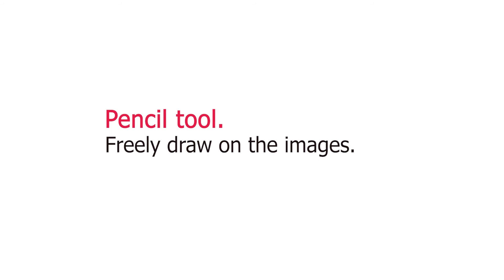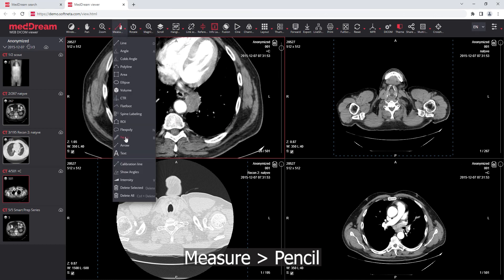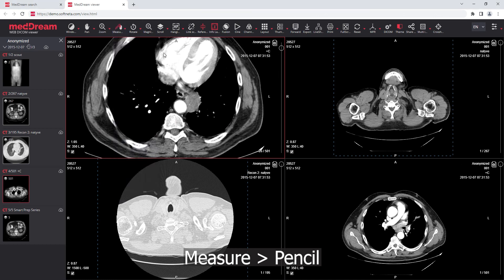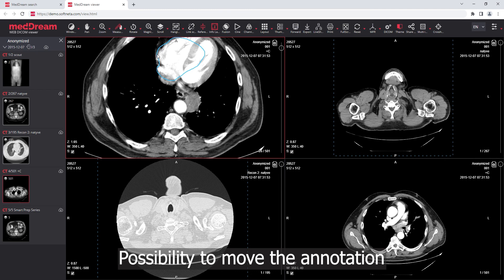Pencil Tool: freely draw on the images. Choose the pencil tool from the measure menu and freely draw on the image. There is also a possibility to move the annotation.